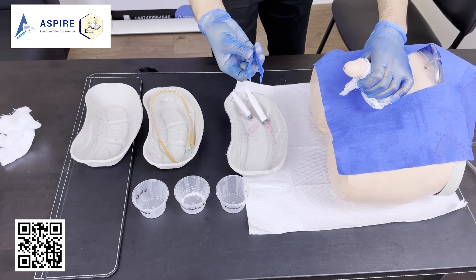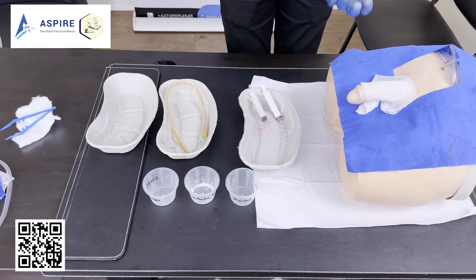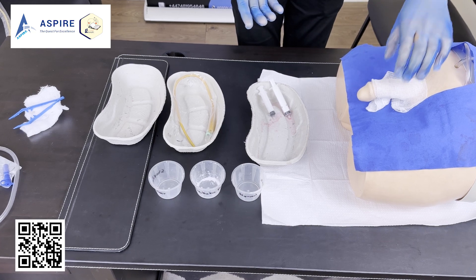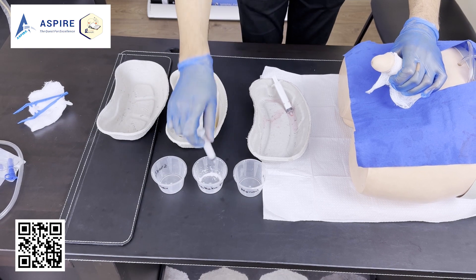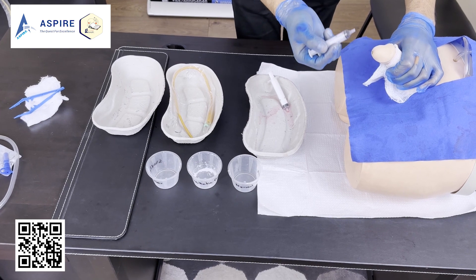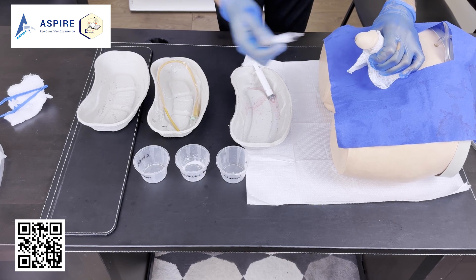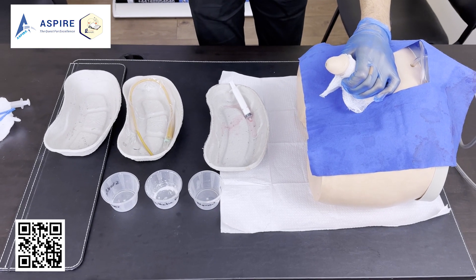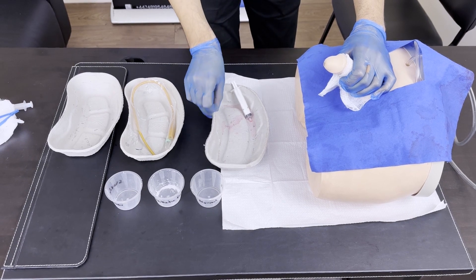You can dispose of the forceps as well. At this point, after cleaning the penis, you can change your gloves. After changing gloves, the first thing to do is apply the anesthetic jelly — fill it into the syringe, warn the patient that you are going to insert the anesthetic jelly and that they may feel a slight sting or cold sensation. It is always advisable to wait a minute or two for the jelly to take effect.